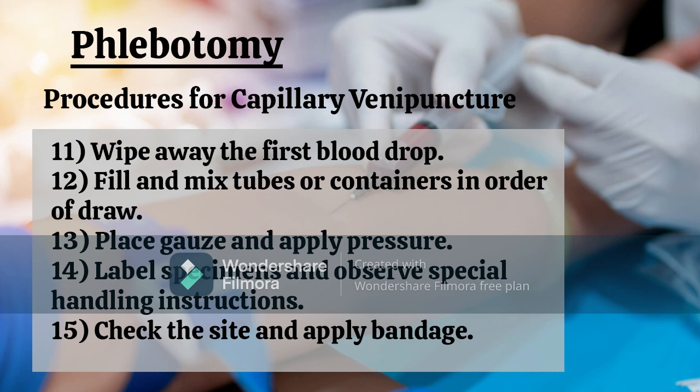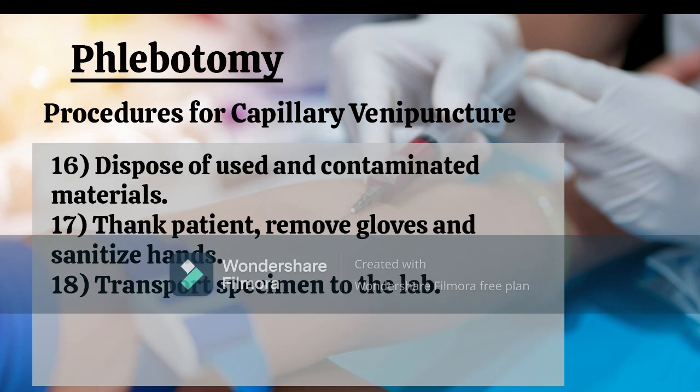14. Label specimens and observe special handling instructions. 15. Check the site and apply bandage. 16. Dispose of used and contaminated materials. 17. Thank patient, remove gloves, and sanitize hands. 18. Transport specimen to the lab.